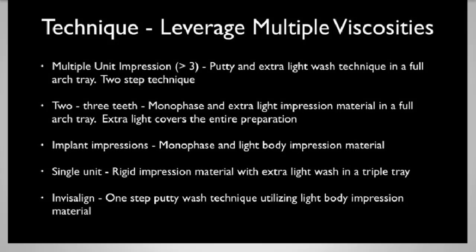For a multiple unit impression, and I'll define multiple unit impression as anything really more than 3 teeth, what I like to do is a 2-step putty wash technique. So I mix up some putty, I put it into a tray, I mold that tray onto a model or maybe in the patient's own mouth, and then create a little spacing around any preps that I want to impress.